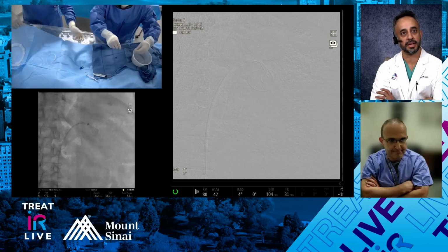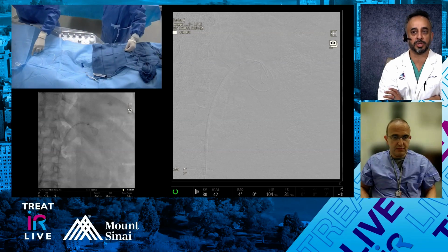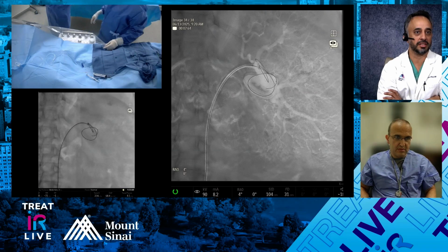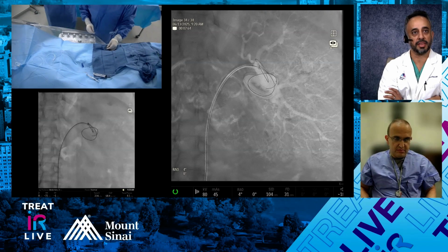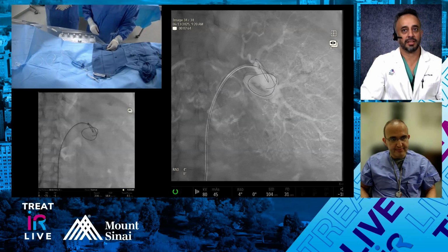There is some data, not necessarily with aneurysms but more with vessel sacrifice, suggesting fibered coils are a little bit faster. I'm not really sure we have data to show that one is really better than the other. Yeah, I completely agree with you too. Thanks for that added commentary, Emil.